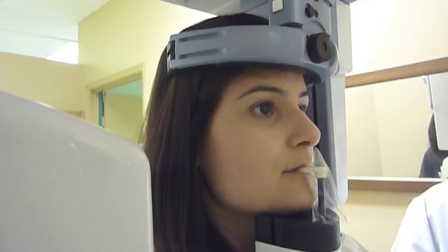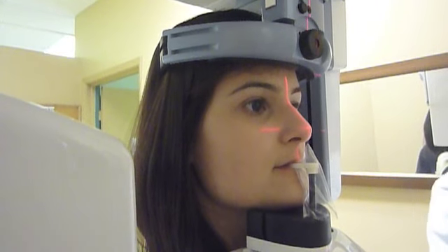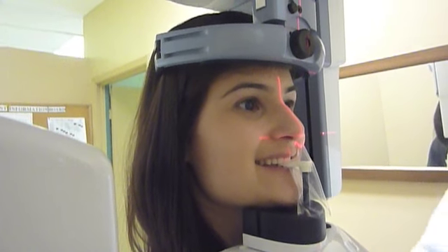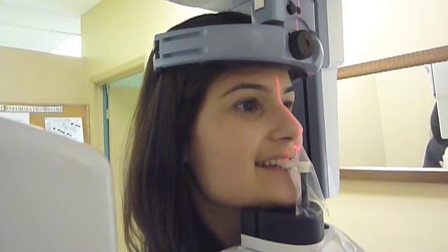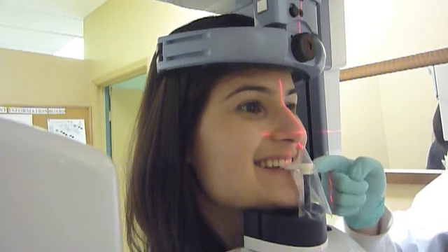Position the lights on the client's face using the light button and watching through the mirror. Line up the face with the mid-sagittal plane. The light should pass through the tragus and infraorbital notch. Ask the client to smile, and based on the position of the canine, choose the layer. It will either be right on the canine, behind, or in front of the canine.